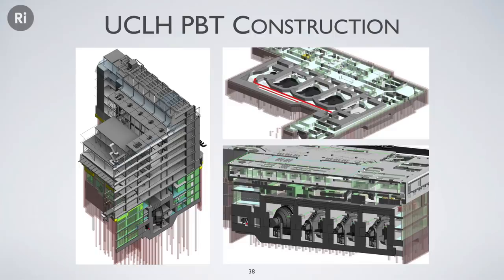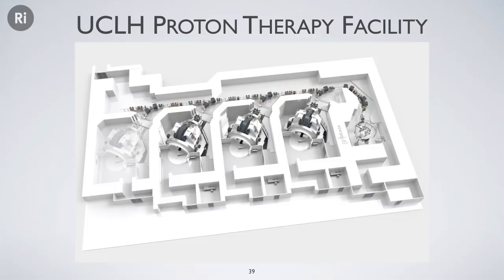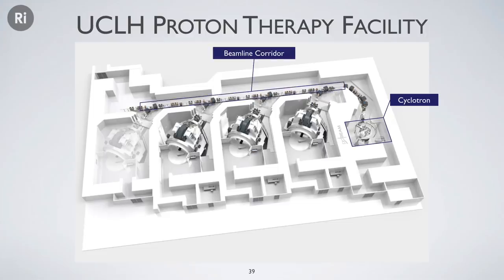If you look at the proton therapy level, this is what it looks like. So the accelerator that we have is actually smaller still than the Heidelberg one. It's called a cyclotron. It's more compact than the bigger synchrotron. That sits over there. Then you need to take the beam out of the cyclotron. And remember I said that as you curve the beam round corners, you actually select the energy that you want. Faster particles don't bend so much. Slower particles bend too much. So you can use that to choose the energy that you want.